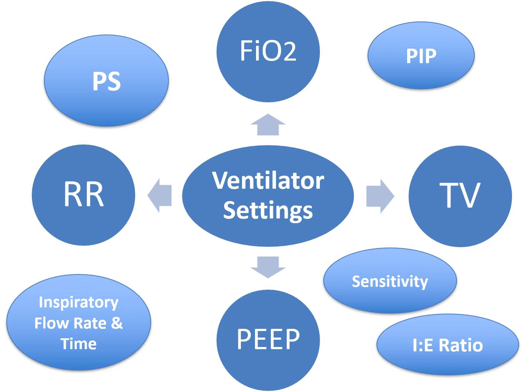We talked a little bit about sensitivity, and this is the amount of effort the patient must generate to initiate a ventilator breath.